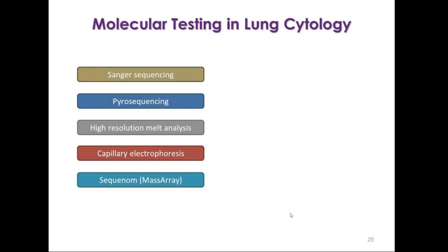Now, every lab utilizes different platforms for doing some of these tests, and as I mentioned, most of these tests were single gene based testing, so either Sanger sequencing for EGFR or pyrosequencing for KRAS. And at some point, given the number of genes that we were going to be testing, it was inevitable that we would require a multi-gene platform.